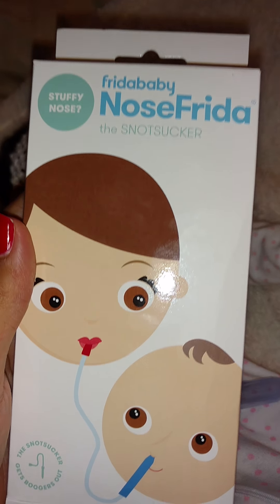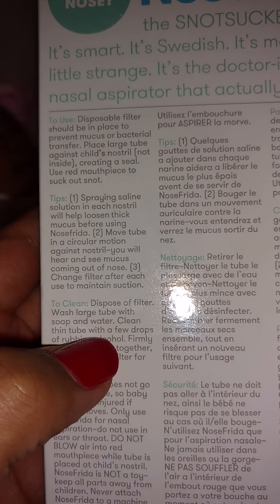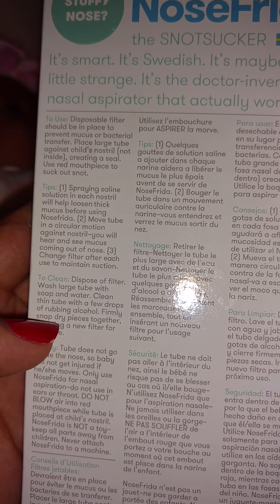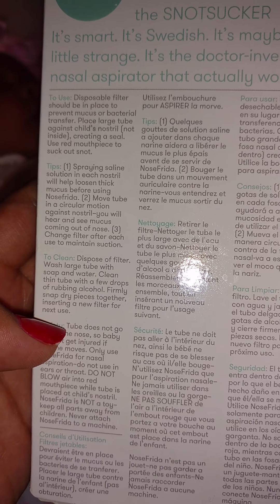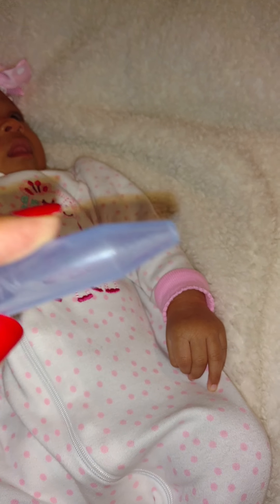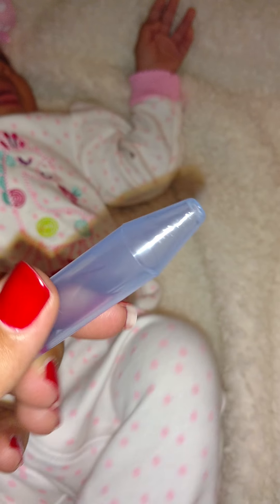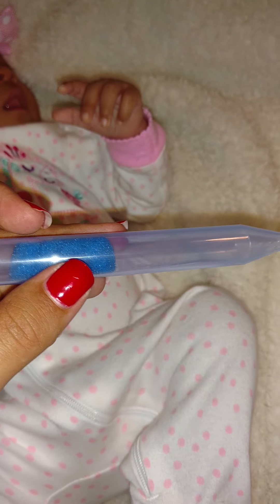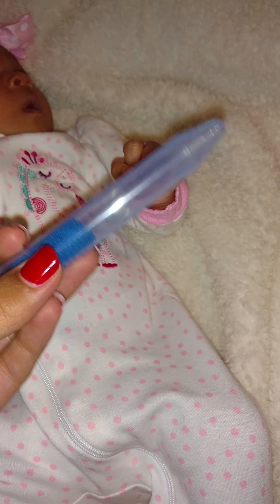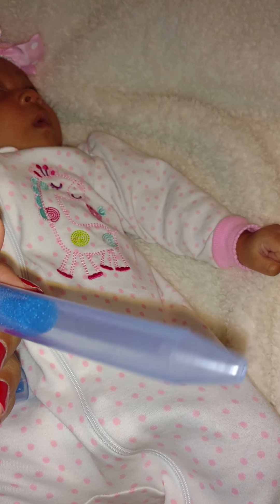Anyways, this is the Nose Frida. Okay, so that part where it said — it's: clean, dispose of filter; wash large tube with soap and water; clean thin tube with a few drops of rubbing alcohol; firmly snap dry pieces together; insert a new filter for the next use. I don't know that much about bacteria in this thing, but why would you have to get a new one of these? I feel like you can take this out and remove this, wash it and use it over again. I don't know if maybe they mean get another one if the snot touches this, but I don't see how the snot can ever touch this. I'm not sure. But I'm gonna buy some more of these and just go from there.